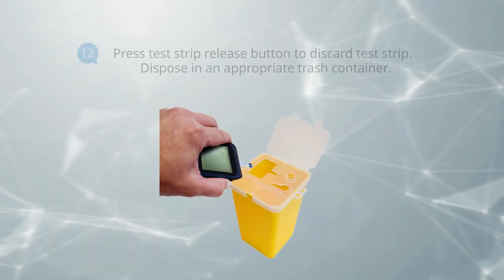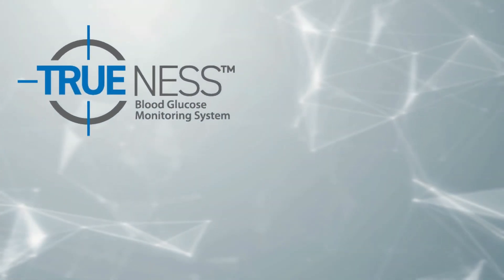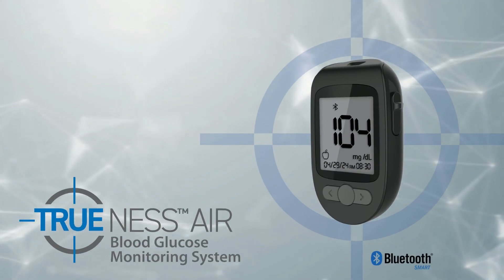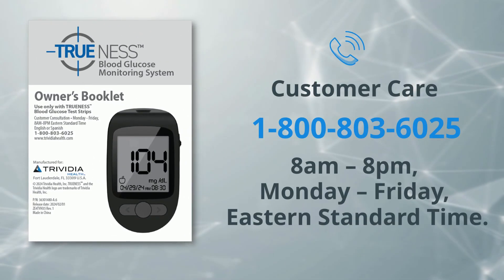Afterwards, hold your meter with the test strip pointing down and press the strip eject button to discard the test strip. The meter automatically turns off. That is it — you have just completed a blood glucose test. For detailed instructions and additional features of the system, please refer to the owner's booklet or call our helpful customer care staff.